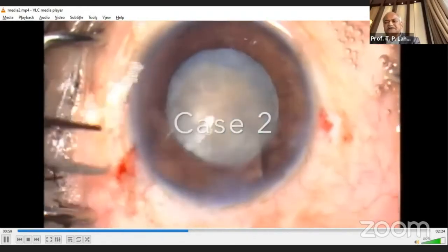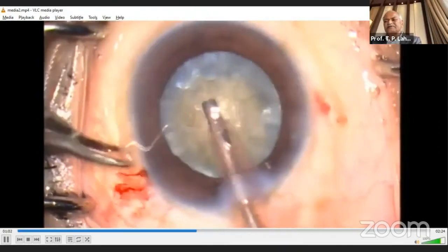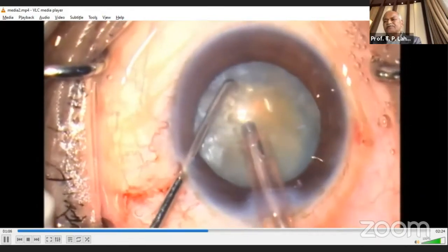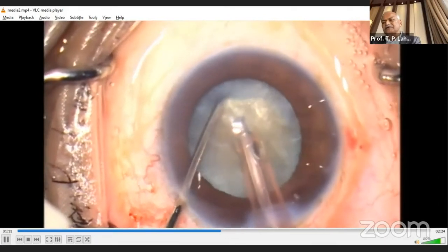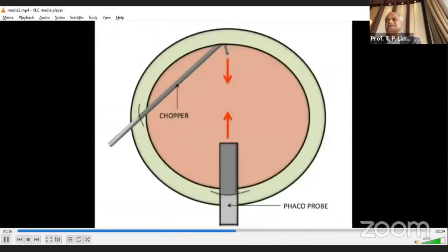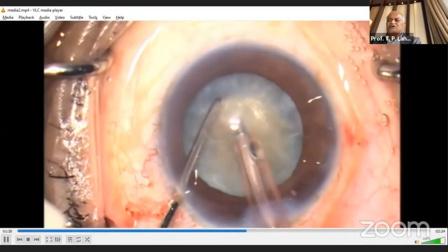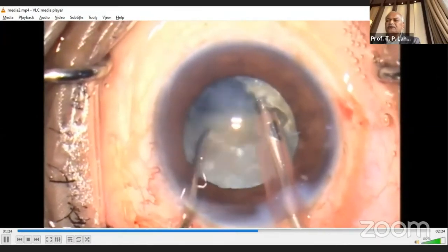Now you see, this is a case where you can see there is so much fibrosis of the anterior capsule. Here again, I'm doing the direct chop. You can see here the two instruments which are in line. You see when I'm going deep and then separate. So your phaco tip and the chopper should go deep and it should be a sharp chopper.